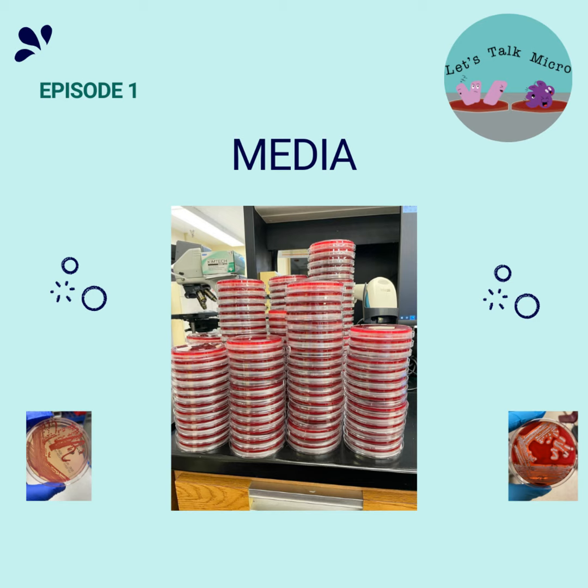Okay, gram-negative what? You see, by leaving it out like that, you are telling me that I can go ahead and put Neisseria gonorrhoeae, a Pasteurella, a Haemophilus, and it will actually grow. And as you know, that's not true.